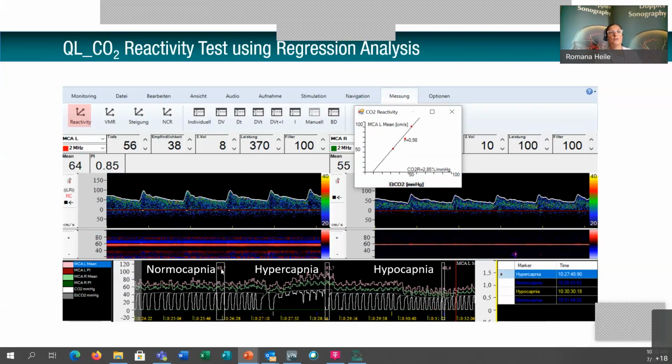First we click on the trends, highlighting what we need for the measurement. Usually it's the mean. Then we can follow with the cursor, which always gives us the number of the value, and we see what is the steady state.